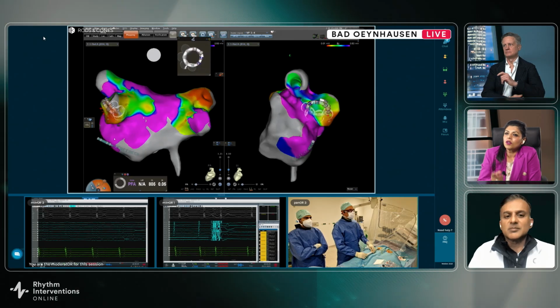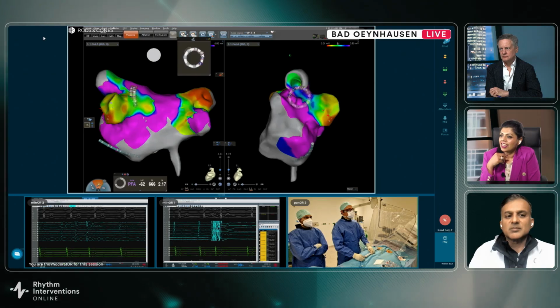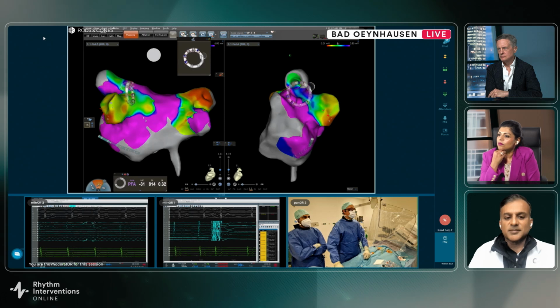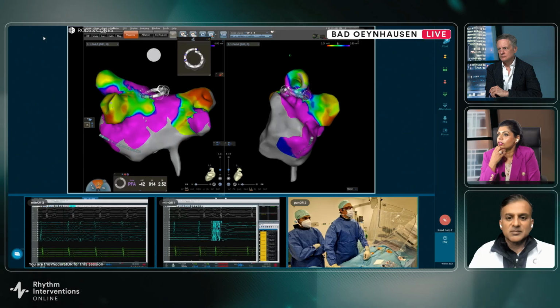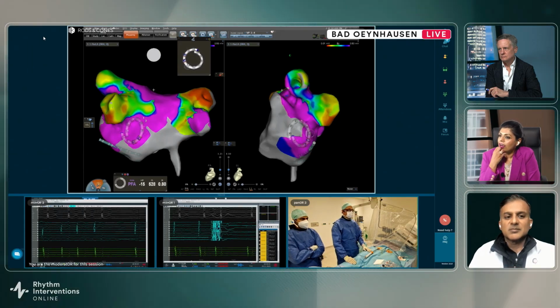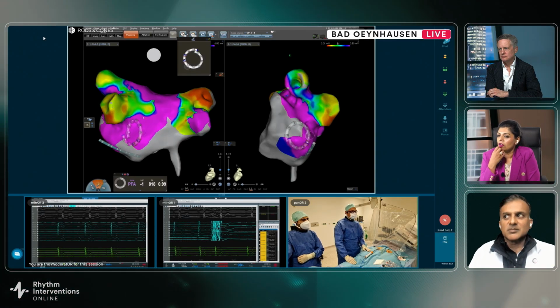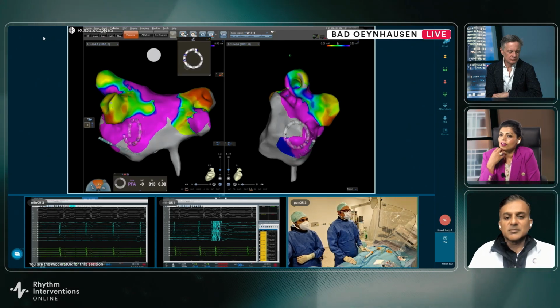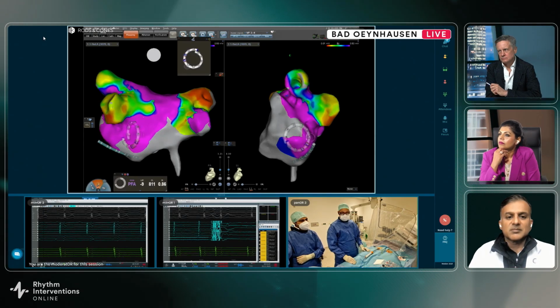Krishnan, I do have a question. You very masterfully got this catheter within the pulmonary vein and got really good ostial positioning. We're starting to see more and more PFA systems come that sometimes don't go inside the ostium, like we just saw a Volt case, we see Cardium, that just sit antrally. How important is it to get this catheter deep into the ostium? And what if the veins are small and it is a little bit stiffer catheter? Sometimes it's not easy. What are your thoughts on just having very good antral lesions? Is that good enough? I think it's very important to have antral lesions.